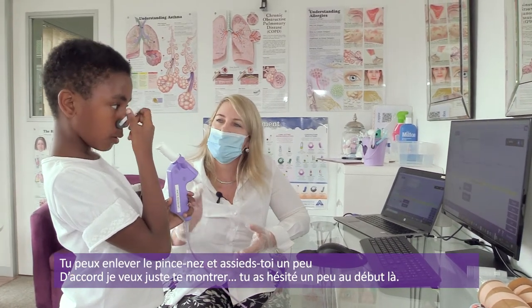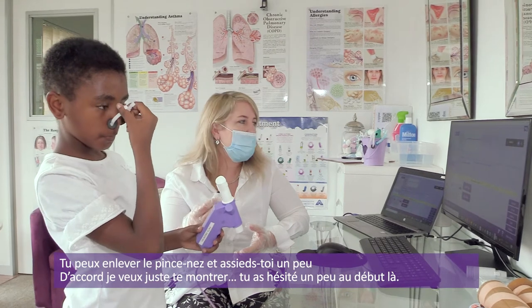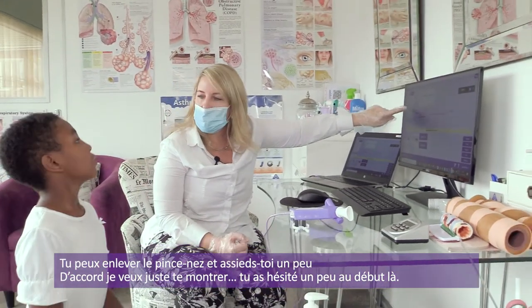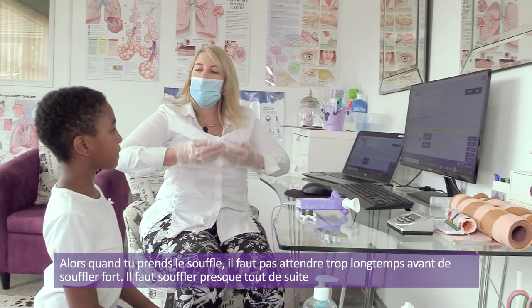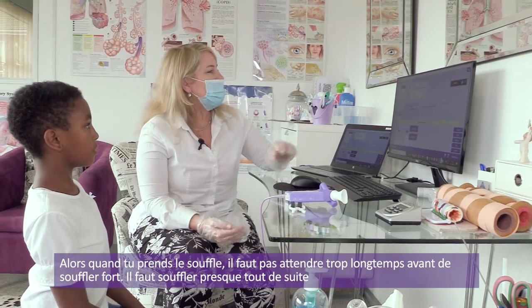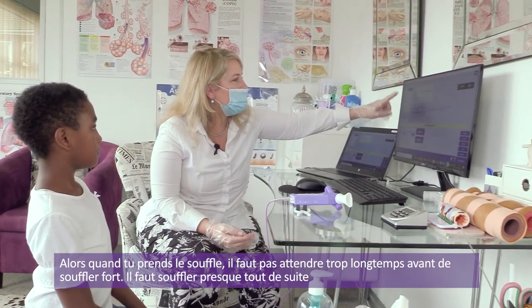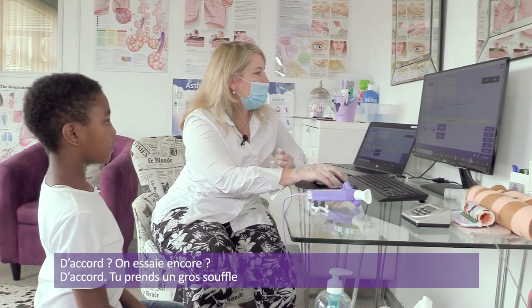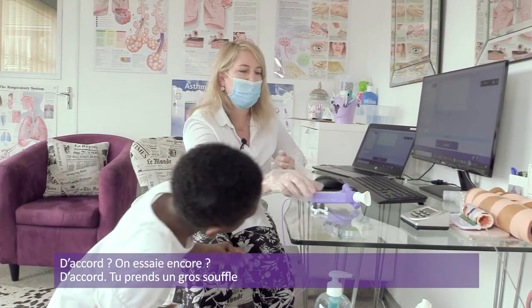Now, take off your nose clips and just relax for a moment. Okay, I just want to show you that there was a little bit of hesitation at the start of your breath there. So when you breathe in, you mustn't wait for too long before you start to breathe out again. You must breathe out almost straight away once your lungs are full. All right. Okay, so shall we give that one a try again? All right.